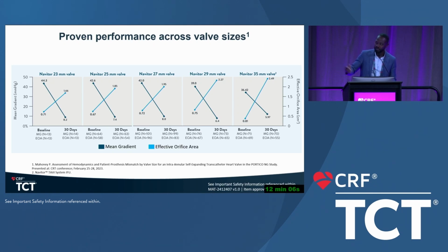Maybe Bassem? No question, and I'm going to challenge you even more by saying, if we are in an area where the surgeons don't do root enlargement, should you send them for surgery and get a 21 tissue valve, or should you actually do a TAVR with them, like Didier is saying, with a platform that gives you good hemodynamics? How would the patient do better? In my opinion, a TAVR with good hemodynamics as a platform will be better than a 21 surgical valve, or even a 19 sometimes. Until STS can get all the surgeons up and trained and there's more awareness about root enlargement, I think that should be our primary strategy.